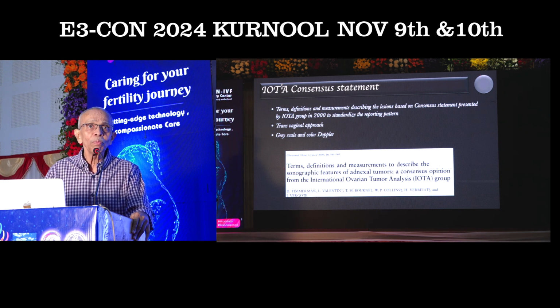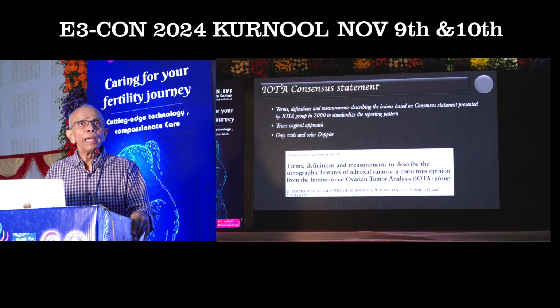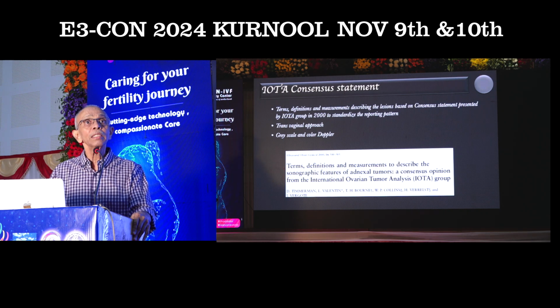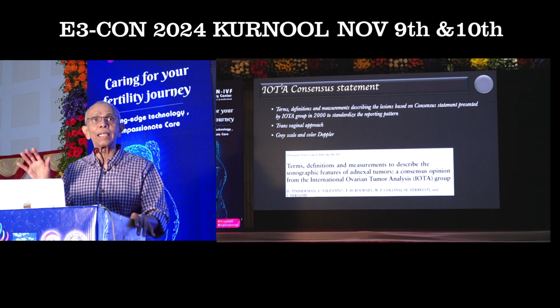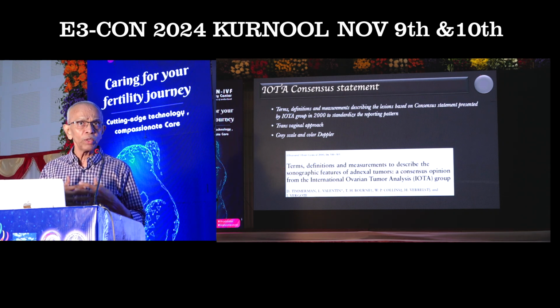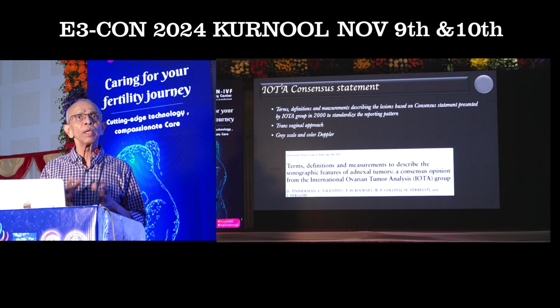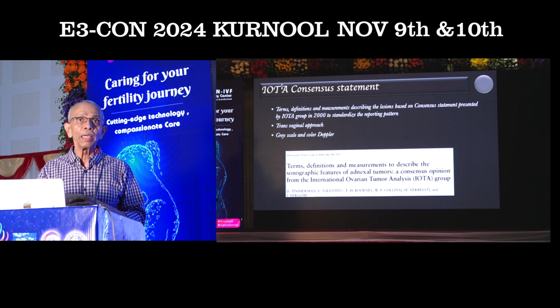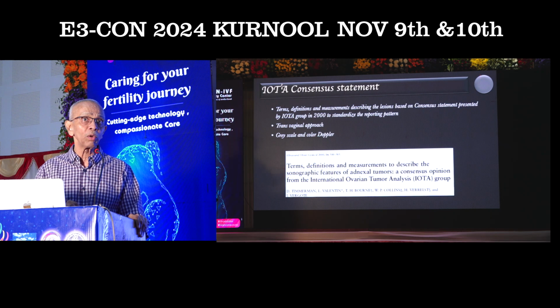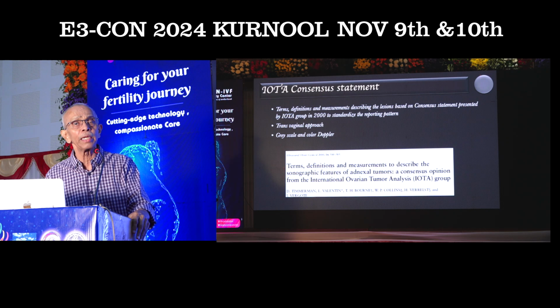The second most important thing I want to tell you is that if you go through all the literature, the need for 3D is very minimal, or I would say negligible. The most important factor when you are trying to evaluate adnexal lesions is the grayscale as well as the color Doppler. Most of the equipment we use in evaluating these pelvic lesions is incorporated with grayscale as well as color Doppler. So we don't need a very high-end machine with 3D acquisition and all. That is one message I wanted to give. So transvaginal, grayscale, color Doppler. That's it. These are the things required whenever you are trying to evaluate an adnexal lesion.